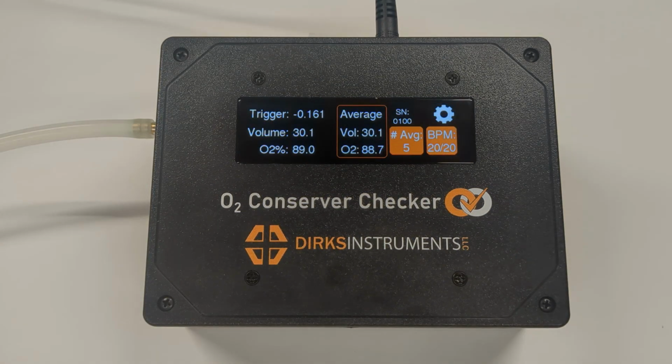On the left-hand side, we have the most recent readings for trigger pressure, pulse volume, and oxygen concentration. If you switch to continuous flow, the volume will be replaced with the flow value.